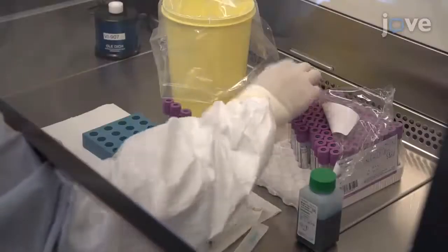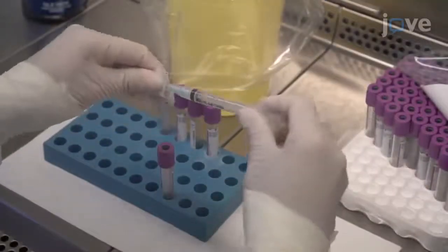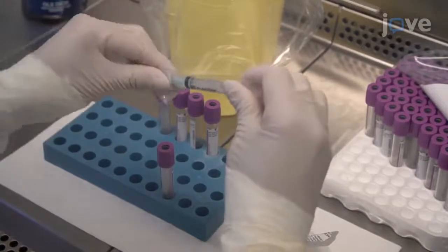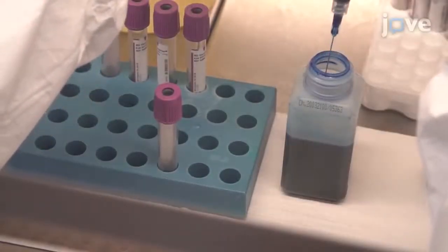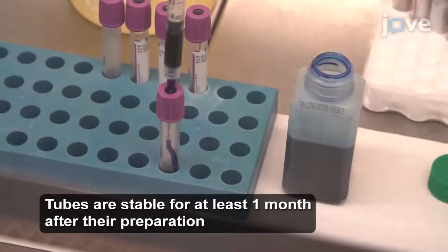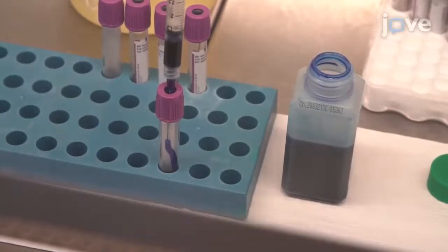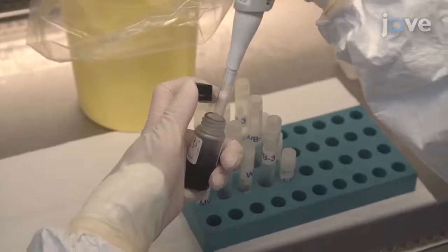Begin by preparing the blood collection tubes. Use a 25-gauge, 1-inch needle attached to a 3-milliliter syringe to inject 1.6 milliliters of a commercial lysis buffer into a 4-milliliter EDTA vacuum tube. It is critical to maintain the vacuum in the blood collection tube for blood collection. Hence, always use a needle to inject the lysis buffer into the blood collection tube.